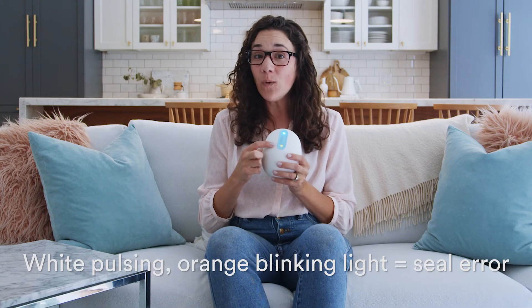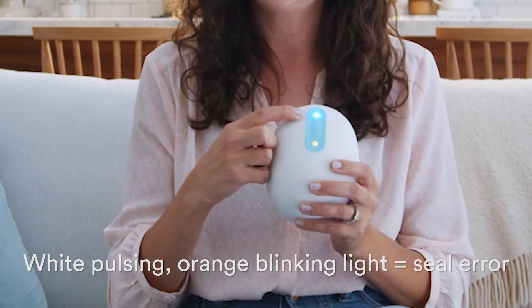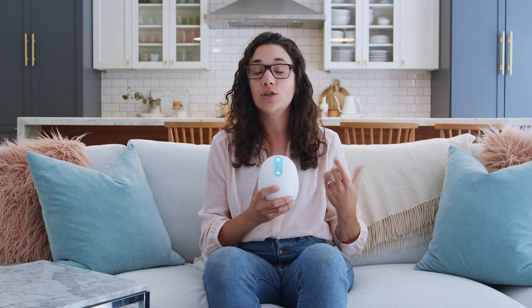If your pump is blinking orange and pulsing white at the same time, it means you need to check your seal. This means there's something between the flange or milk container and your skin. Make sure that there's not a bra or fabric in the area.